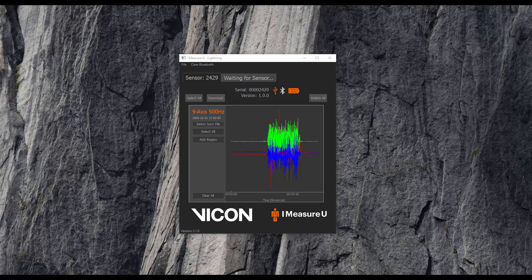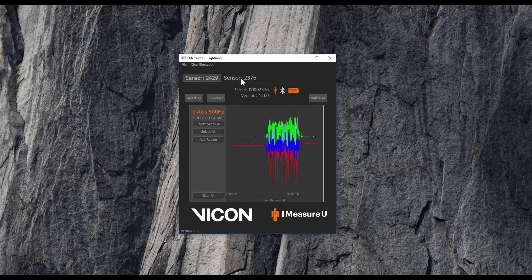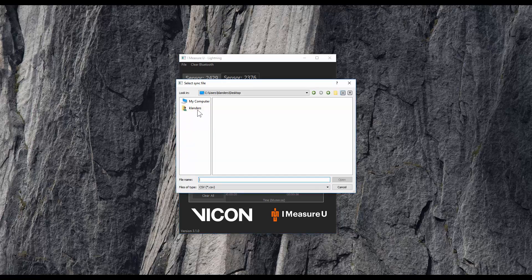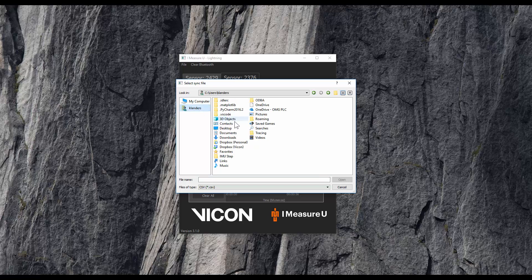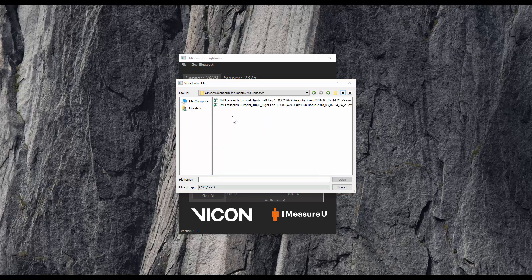We will have 2429 for the right leg and 2376 for the left leg. Within each sensor, we can see a preview of the data collected below. To download this data, you will need to do two things. The first is to select a sync file. I will navigate to the folder location where I saved the previously emailed sync file. Knowing that 2376 corresponds to the left leg, I will go ahead and select the correct sync file.